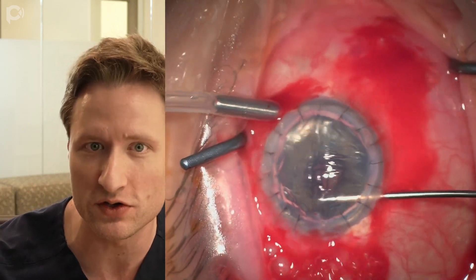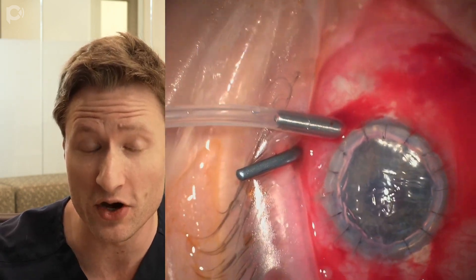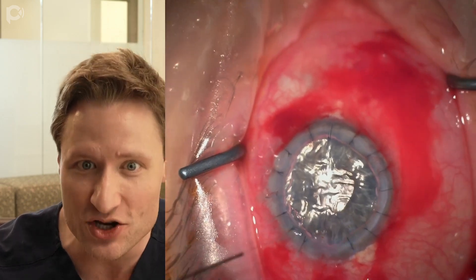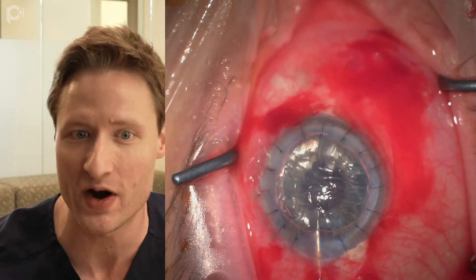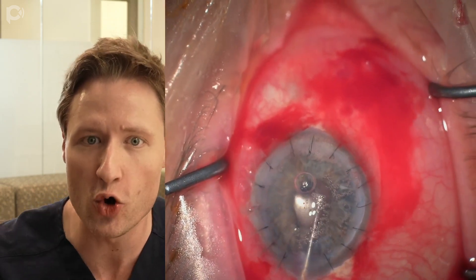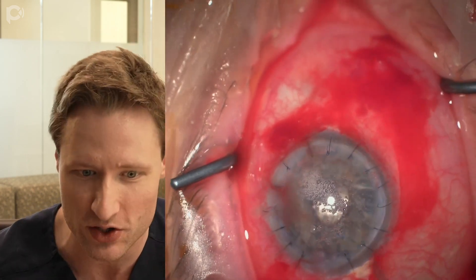People who don't do DMEK in eyes with previous PK and then get detachments — the reason you're getting a detachment is because you have unstripped edges of Descemet's membrane interacting with the graft, or because you're using a graft that overlaps the recipient rim. So it's very important to use a smaller diameter graft.